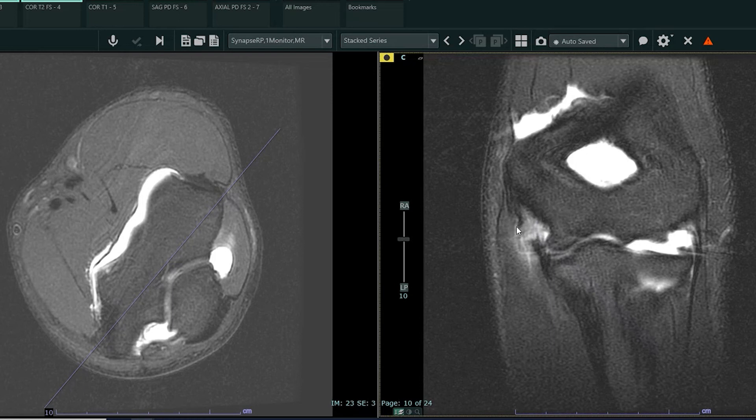We also see partial thickness tearing — low-grade partial thickness tearing of the common flexor tendon. These structures are often injured together in pitchers. This is also known as the flexor pronator mass. So this is a patient who's going to be a surgical candidate. This is a competitive high-level pitcher who was experiencing significant pain and heard a pop. And so we can see that this is a full thickness UCL tear.